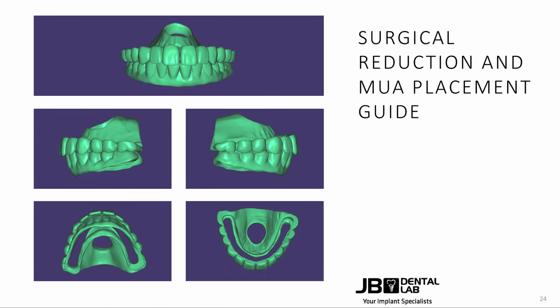Now that we have our teeth set in the proper place, our designers can send you tools such as these surgical reduction and multi-unit placement guides to print out and be ready the day of surgery.